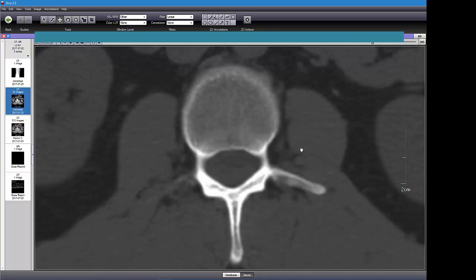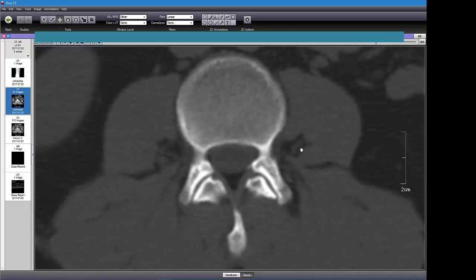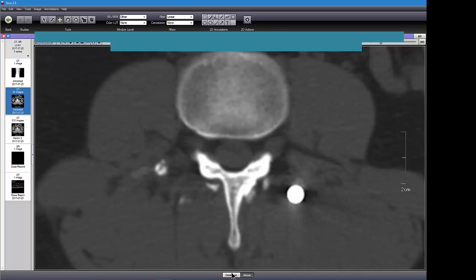Okay, do I need to say anything? Let's go over his MRI real quick. All right, let's get his MRI.